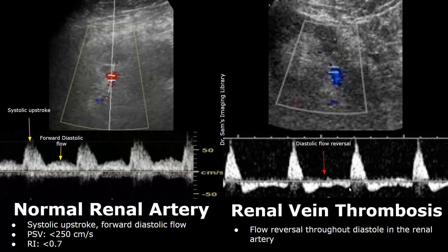We may find flow reversal throughout the diastole in the renal artery, as seen in this image. This waveform is of the renal artery — this flow is seen below the baseline, indicating flow reversal.